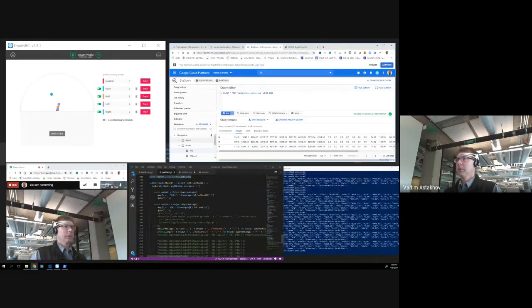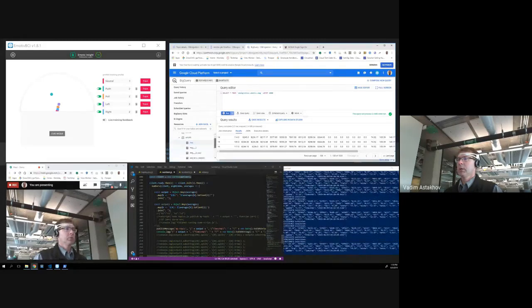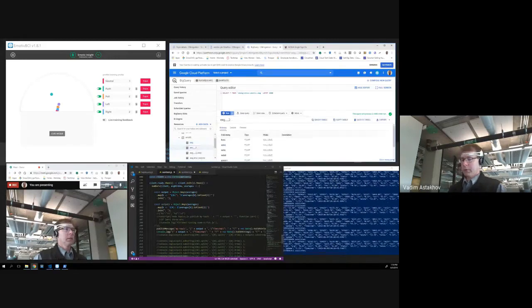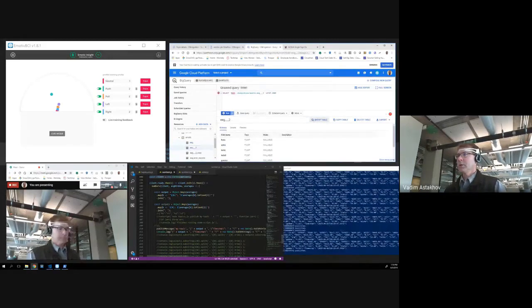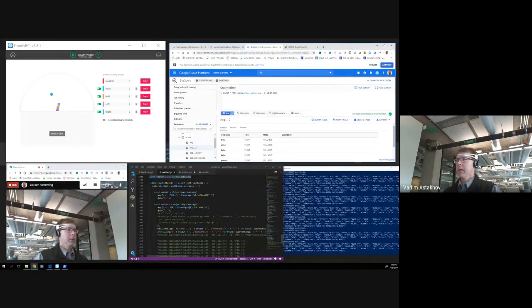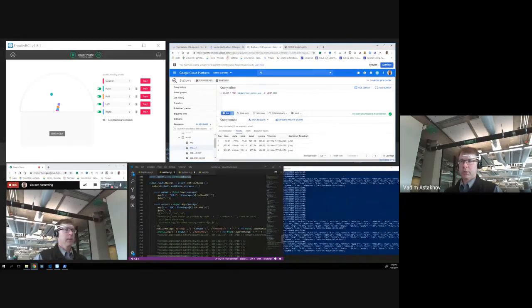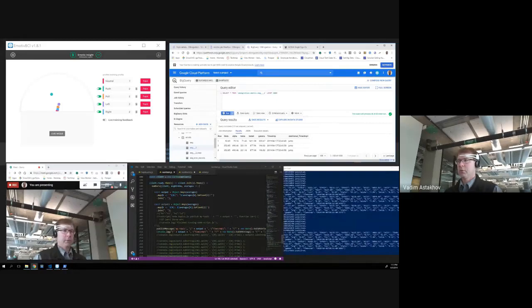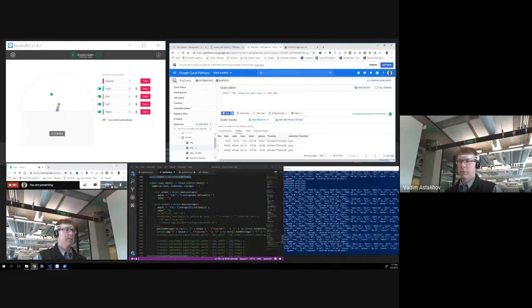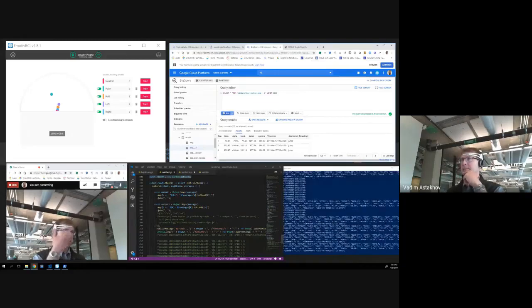So I have another Dataflow that takes this table, cleans it a little bit, and creates another simple table with just electroencephalography data like this. And it also has the annotation that is associated with this. The annotation is used to train the model. It's basically annotation that is really relevant to the mental command that I'm actually thinking during the time I collect the data.